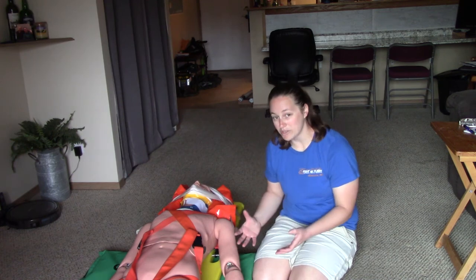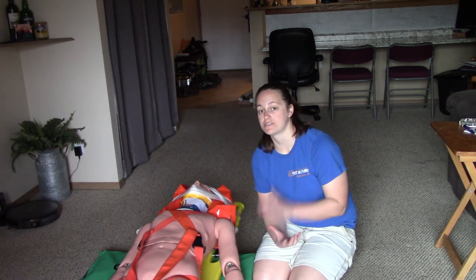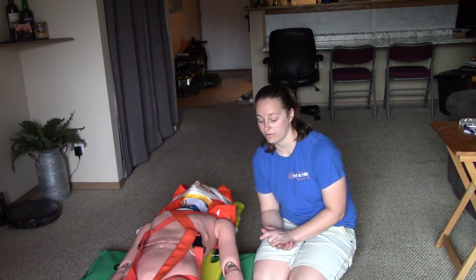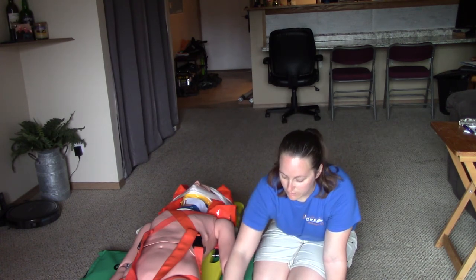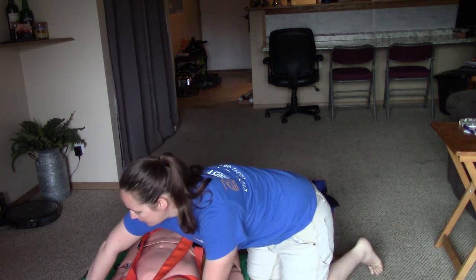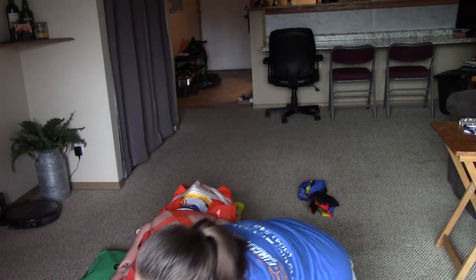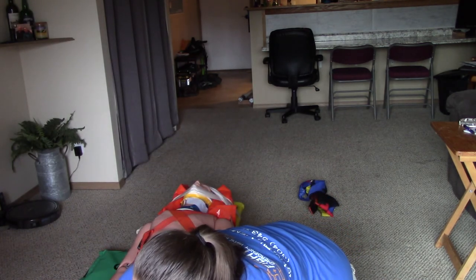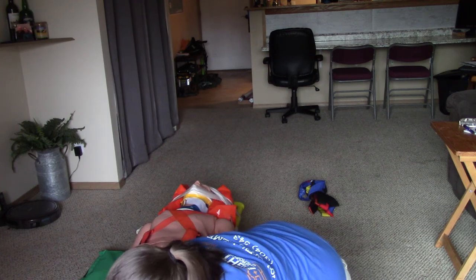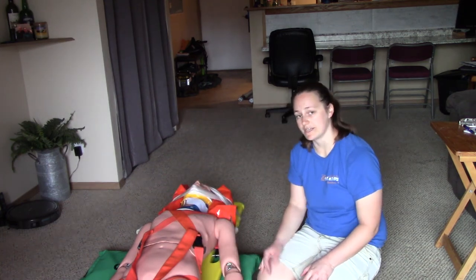My very last step of the station is the same way we started: I have to check circulation, sensation, and motor in all four extremities. I check for a pulse, ask which finger I'm grabbing, and ask them to squeeze my hand — doing this for both hands. Then check for a pulse at the feet, ask which toe I'm grabbing, and ask them to wiggle their toes — on both feet. And that concludes the backboarding station.